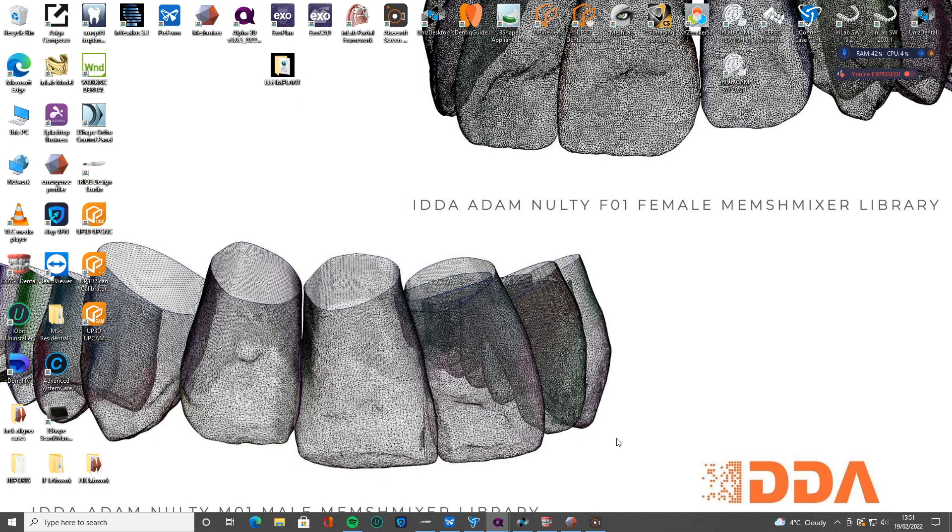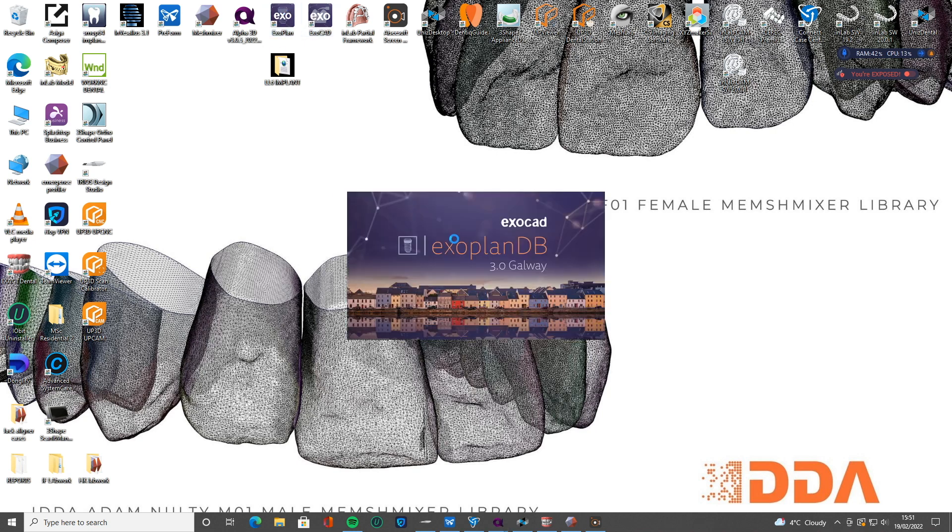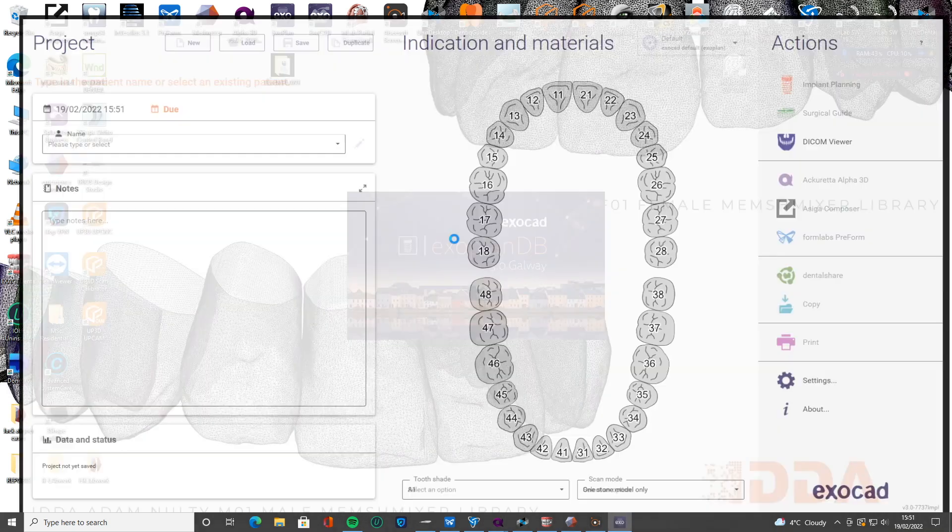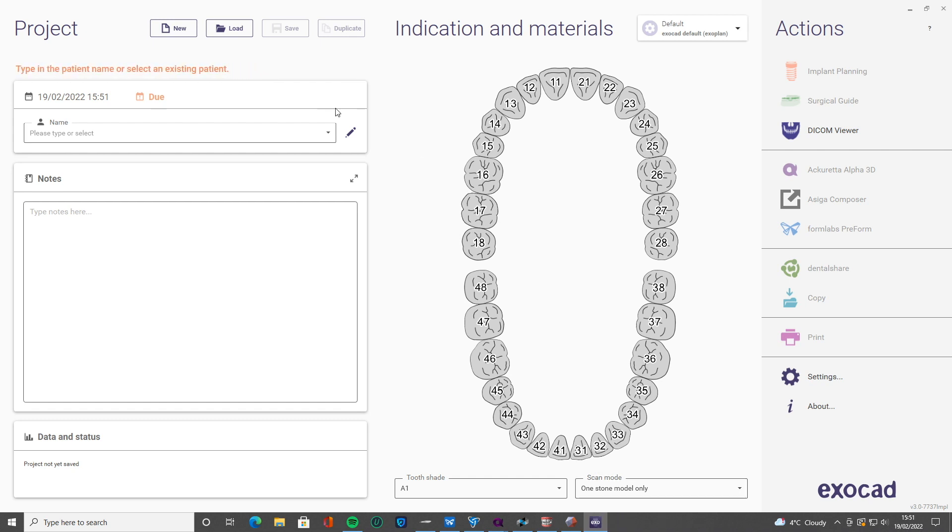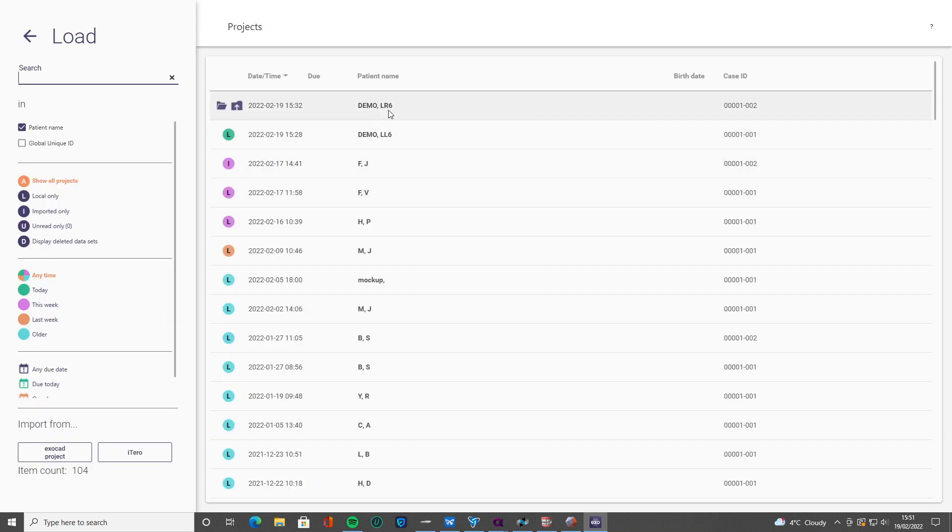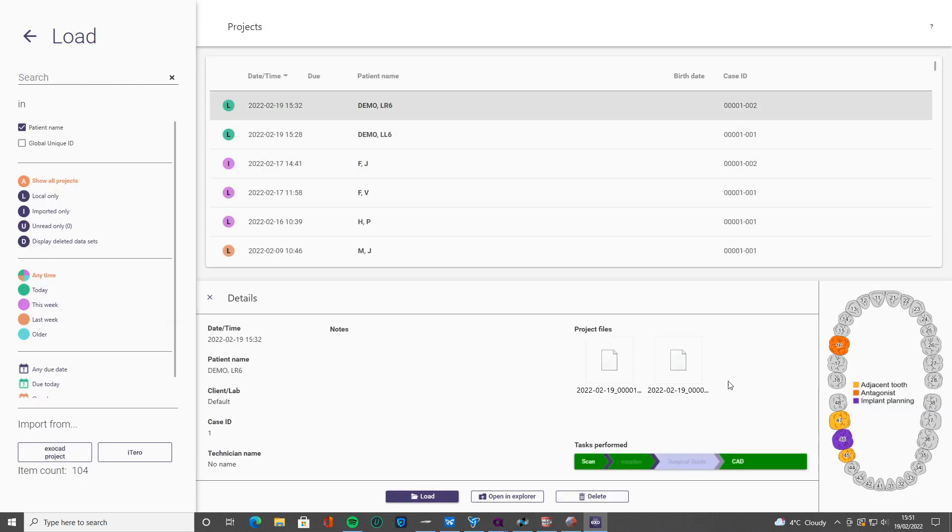The only other part we didn't cover in Exoplan is the actual guide design. Once we've got the guide, then we've got all the parts we need ready to go for the implant placement where we're going to place the implant and have a ready-made temporary crown. So obviously we need the guide for that.